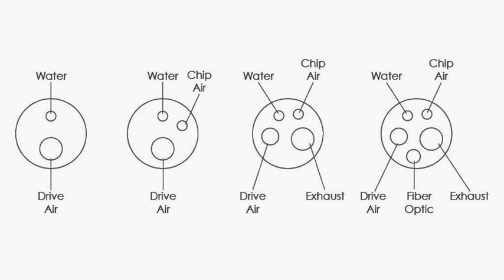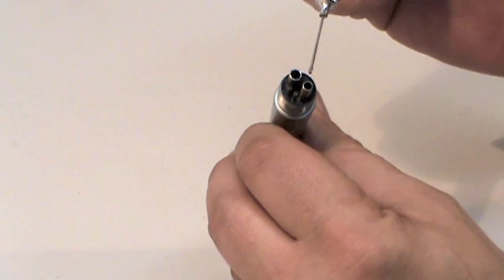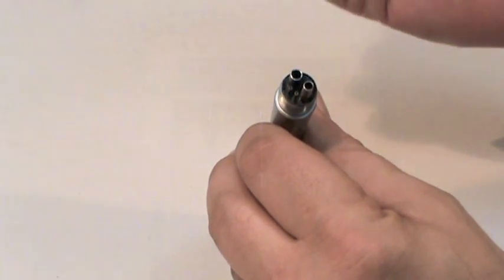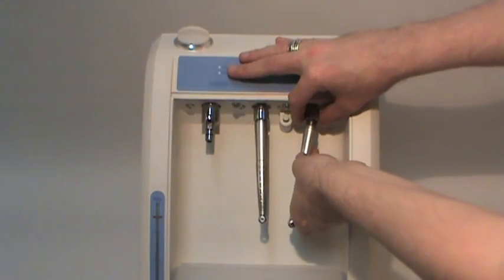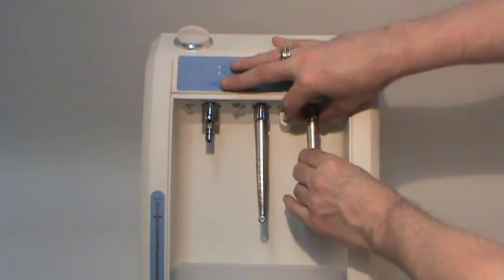Handpiece lubricants and cleaners are only sprayed or dropped into the drive air hole of a handpiece. The exhaust hole does not connect to the turbine. Flush or purge your handpiece after every lubrication and before sterilizing.